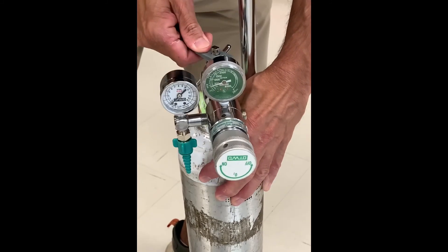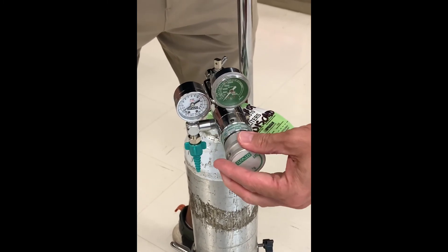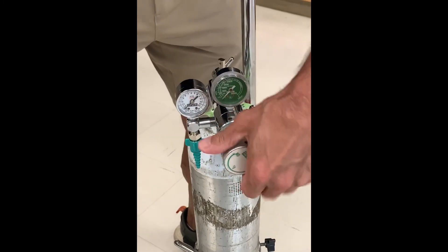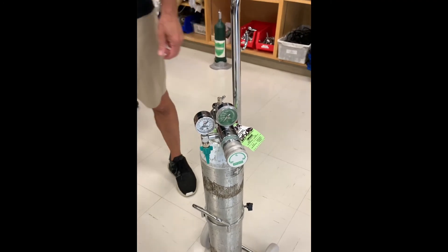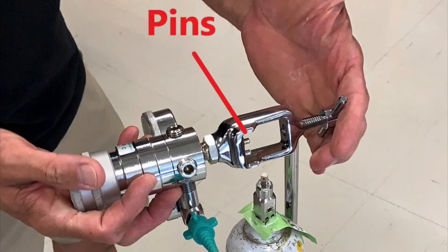If you're not going to use the cylinder anymore, you may want to remove the regulator. Turn the cylinder post valve off by turning it clockwise. Vent the pressure out from the regulator by turning the flow on and then turning it off — this allows you to remove the regulator. The pins for a specific gas regulator will only fit onto the cylinder post of a cylinder containing the proper gas, which is part of the safety system.